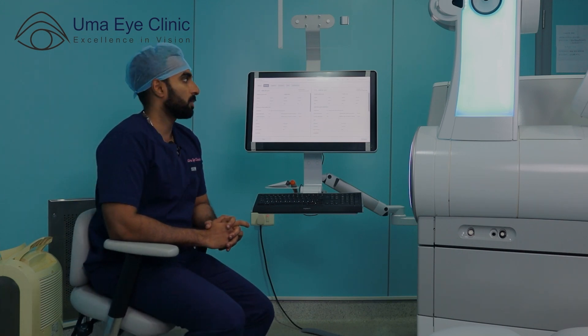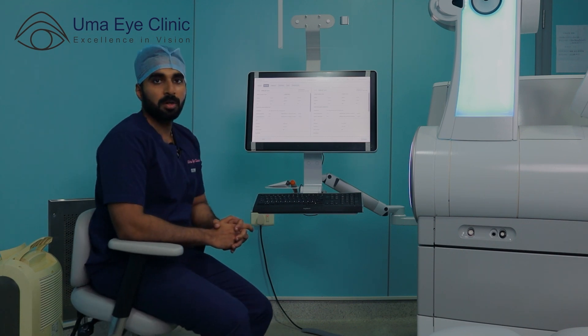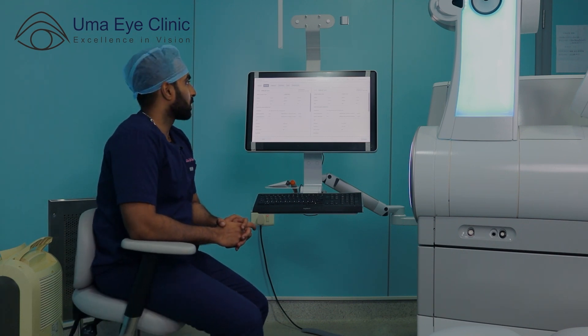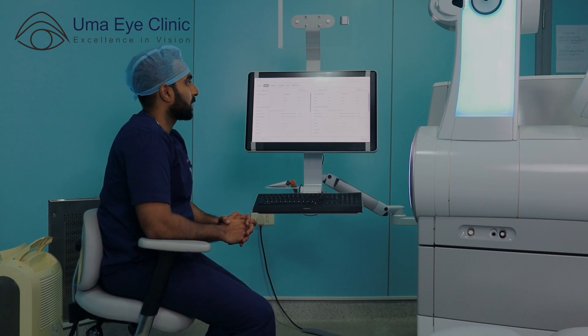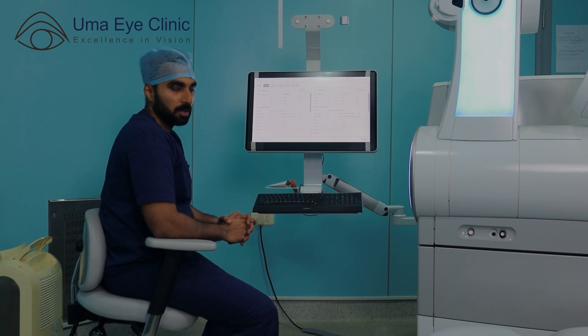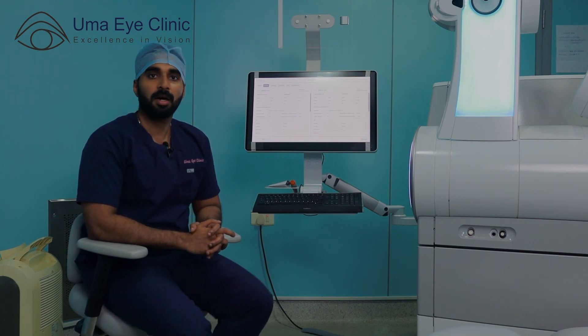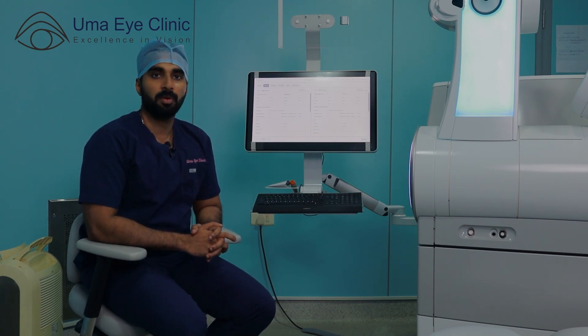If you look at the patient's details, they are around 30 years old and both eyes are minus 10. As we can see, they are almost minus 10 power. Yes, we can correct this with Smile Pro laser.